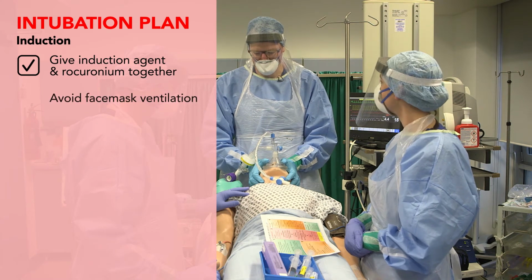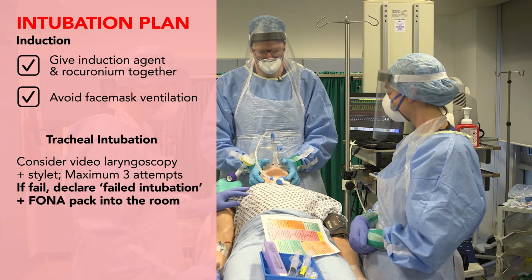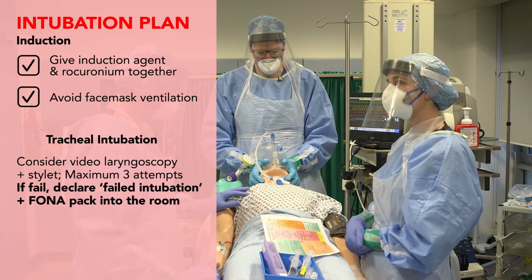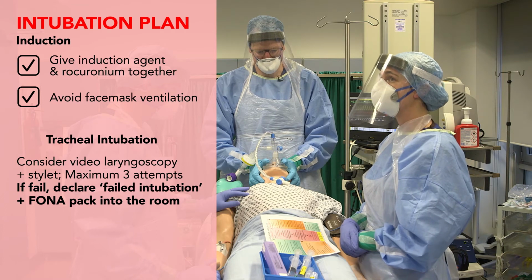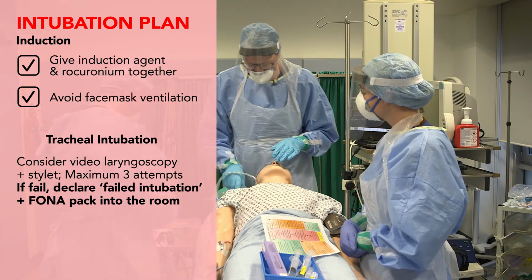And I'm not going to hand ventilate the patient unless clinically indicated. And that's 50 seconds.